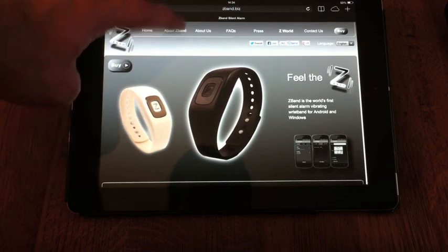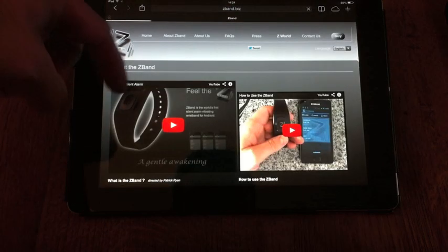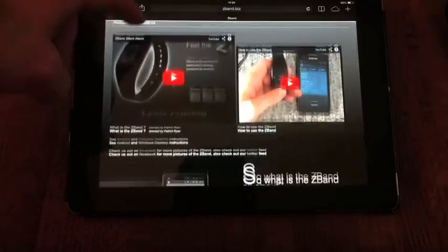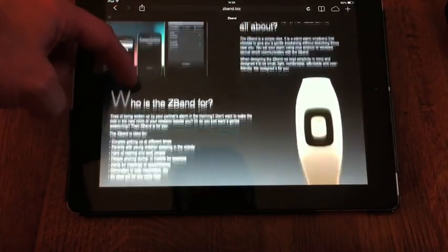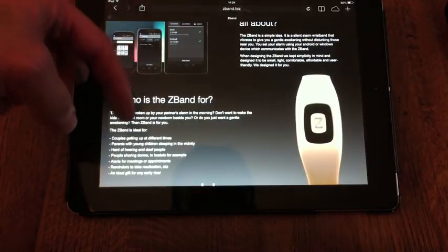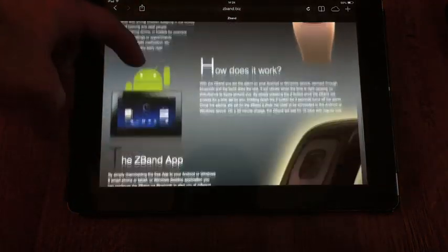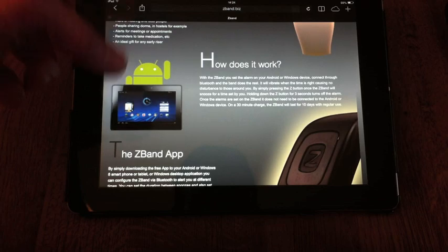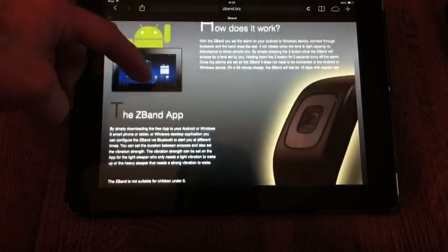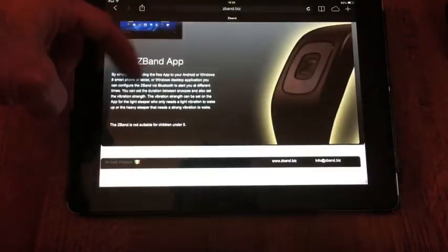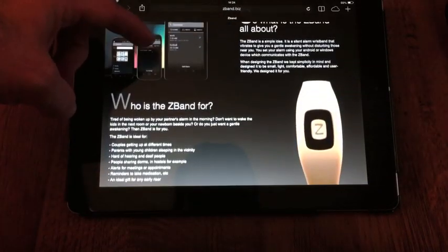This is the Z-Band. I'll just have a look at their website. So it tells you what it's about, how it works. You actually need a mobile phone to pair it with via Bluetooth for it to work properly.